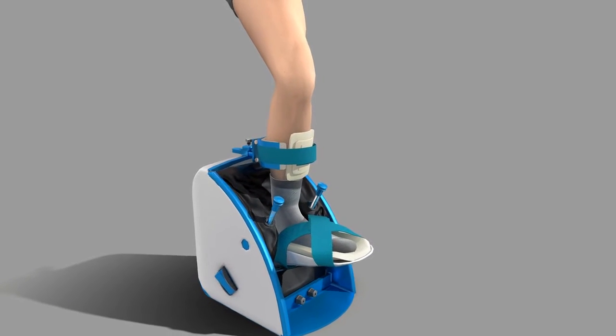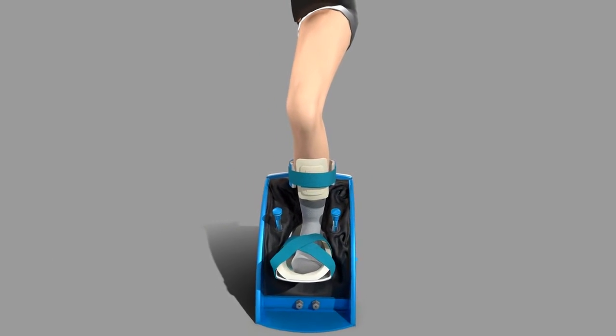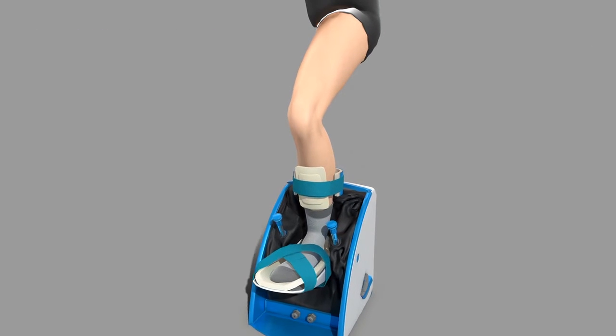Welcome to Modus Nova Foot Mentor. Before we begin, it's important to understand what this device looks like when it's properly worn. But don't put the device on just yet. We're going to walk you through the process step by step.